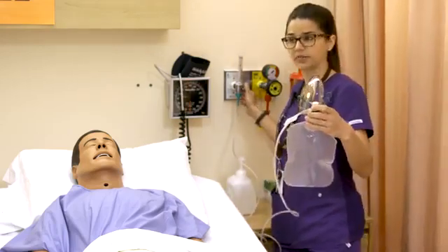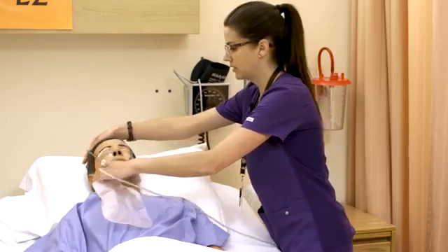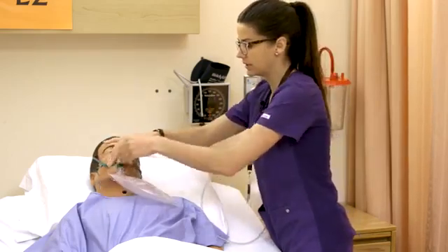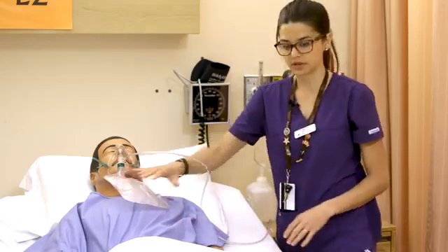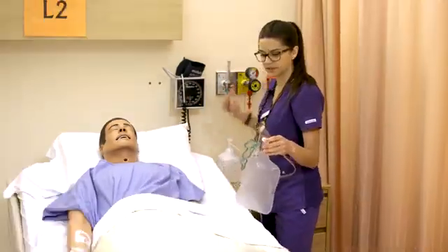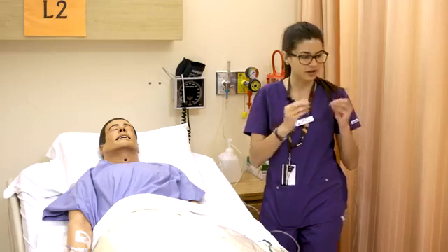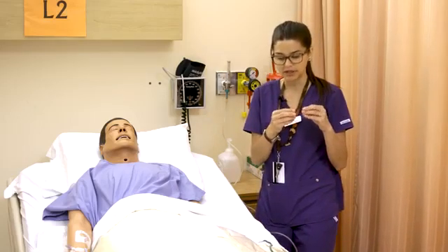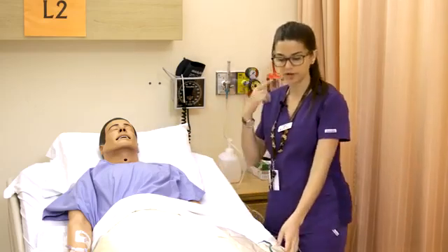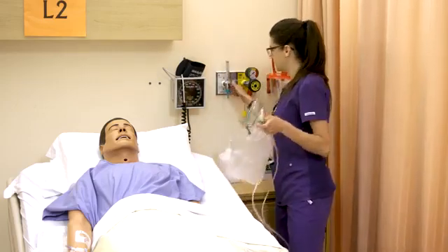The modified non-rebreather can be eight to fifteen liters — this is our high-flow option. You put the mask on the person's face, attach it over the bridge of the nose, and make sure the reservoir bag is nice and full. With oxygen delivery, you'll notice pretty much all these delivery systems have tubing or a mechanism that goes around the person's ears, which can be irritating. You can use gauze pads or spongy tube holders to protect the person's ears, and you want to be checking their skin back there quite frequently if they've had oxygen on for a prolonged period.